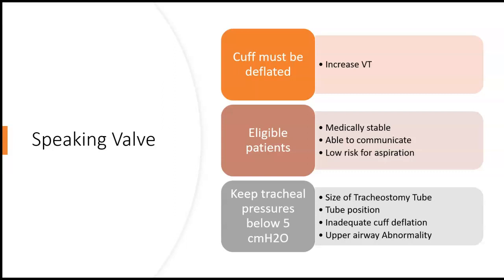With using speaking valves, you want to have cuff pressures, or tracheal pressures, be maintained below 5 centimeters of water pressure. Okay, and that is just to ensure that the patient isn't having excessive strain on their airway while they're using this.